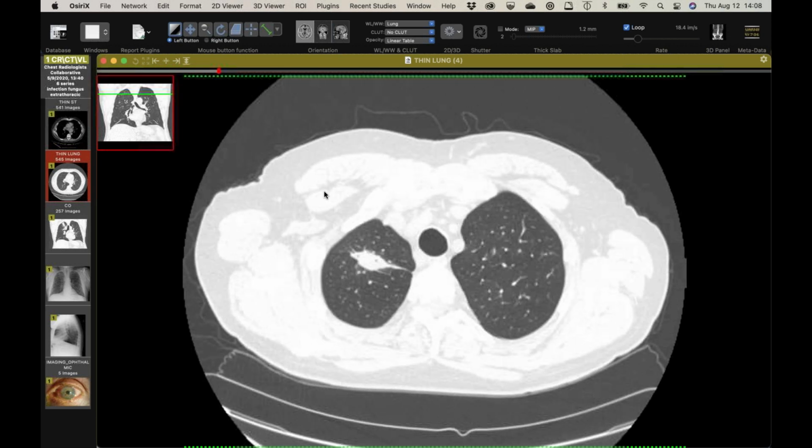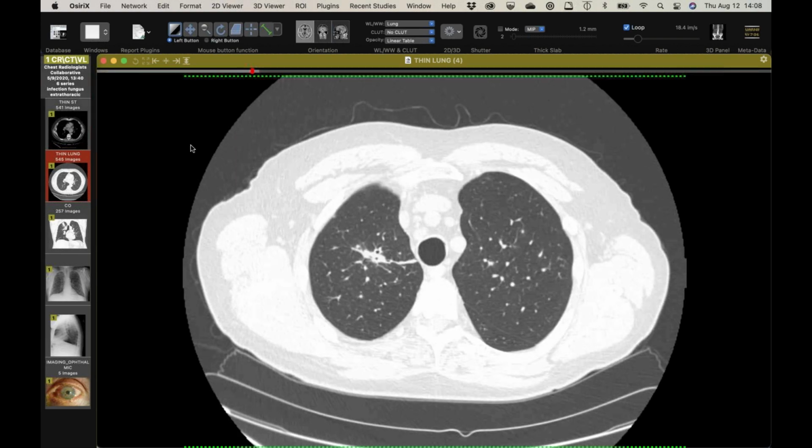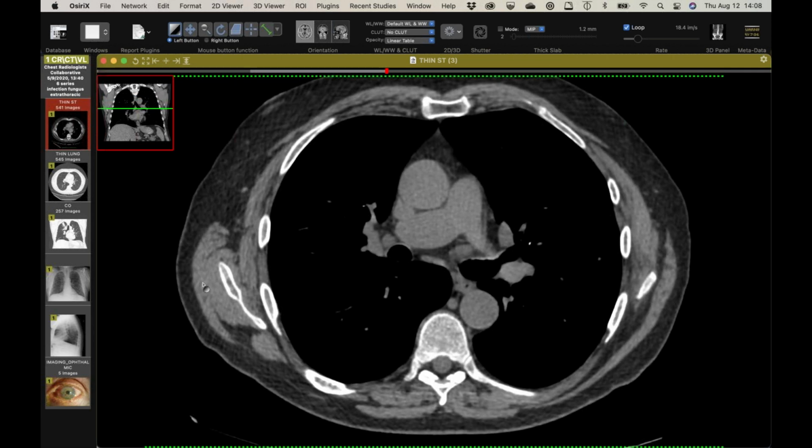So all he had was this nodule or mass here. It's got some airways passing through it, and then he has an enlarged paratracheal lymph node. But he was briefly in Arizona, and so this is a case of coccidioidomycosis, which of course we don't see a lot of here in Wisconsin other than travel. But I've been doing some reading about it recently, and you guys know this because you've practiced out there. But you don't need a lot of exposure. You don't need to be there for prolonged periods of time.